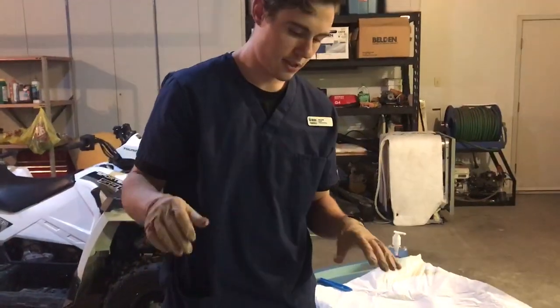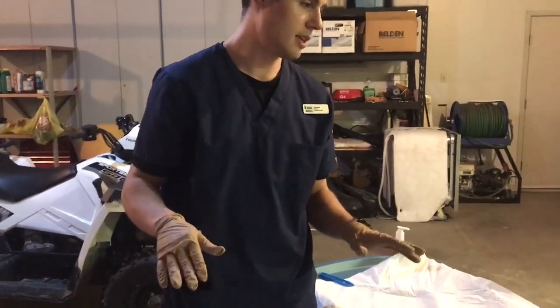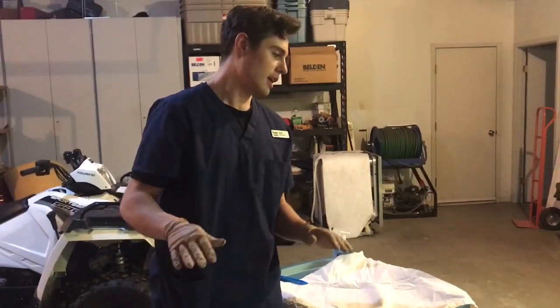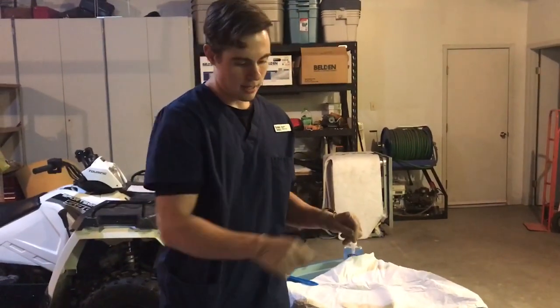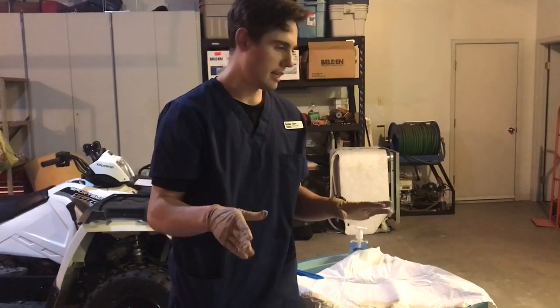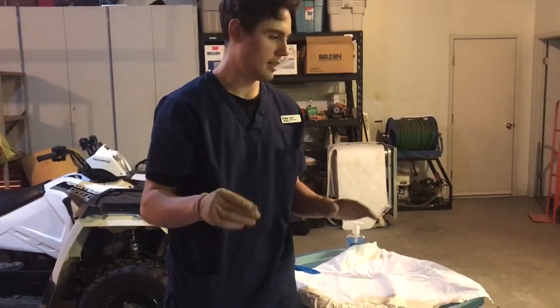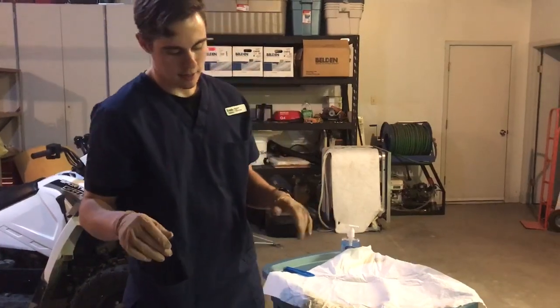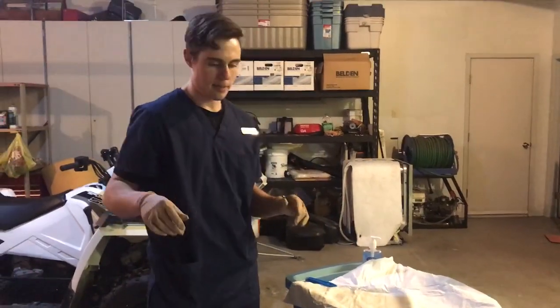After that, I'm going to make sure the patient's comfortable, and I'll lower the bed to the lowest position. Then I will make sure the call bell is within reach, ask them if they need anything else before I go. They say that they don't need anything. So then I will leave the room and I'm going to document on the procedure.